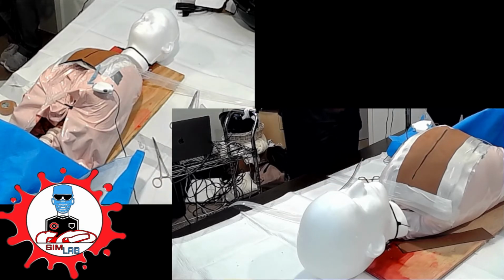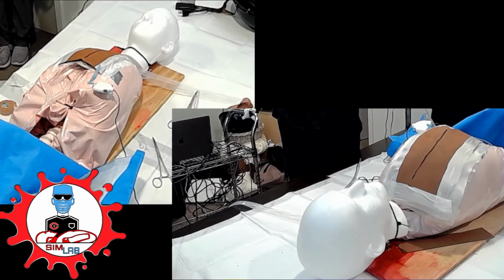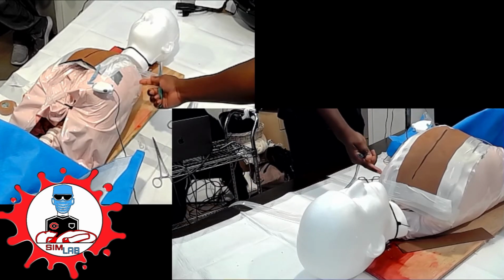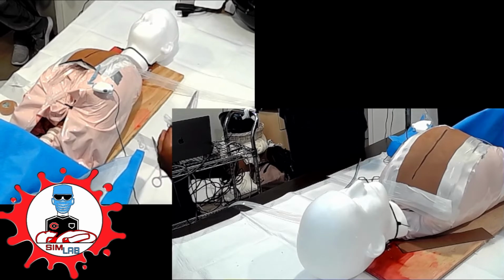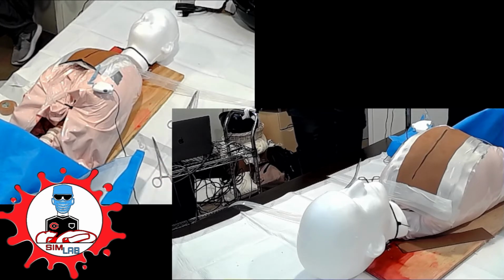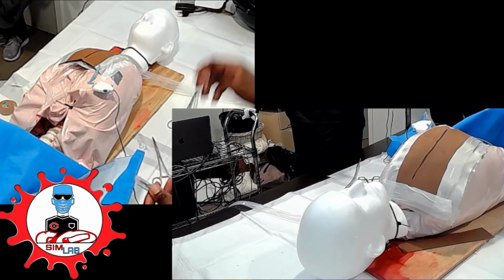Alright, so I guess we're putting in the surgical chest tube. Alright, surgical chest tube. So basically, we're going to go to the mid-axillary line around the 4th, 5th intercostal space. So think of your triangle of safety, right? Where the lat comes down, the pec comes down, your axilla in that area. So arm up. And if the patient is awake, numb pretty good all the way down to the pleural space.